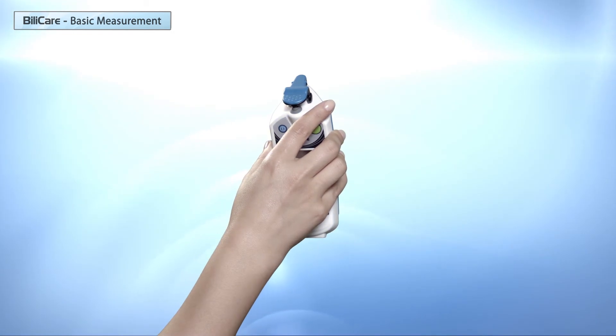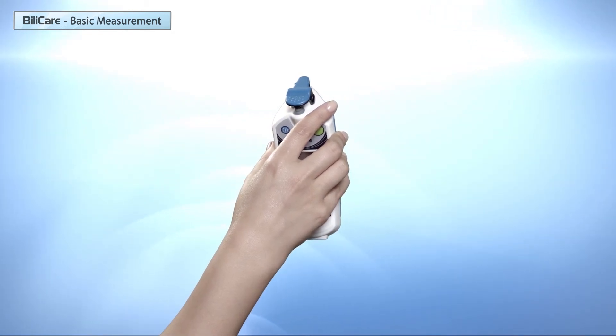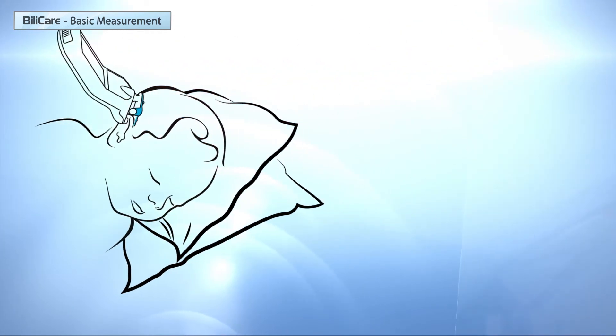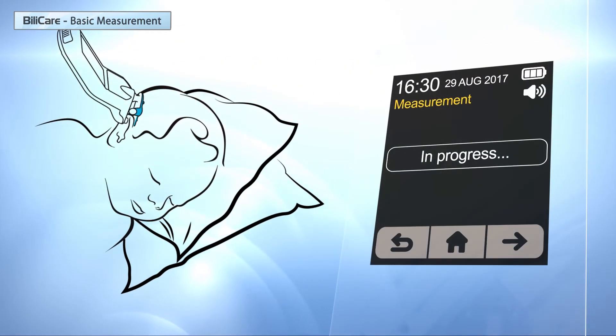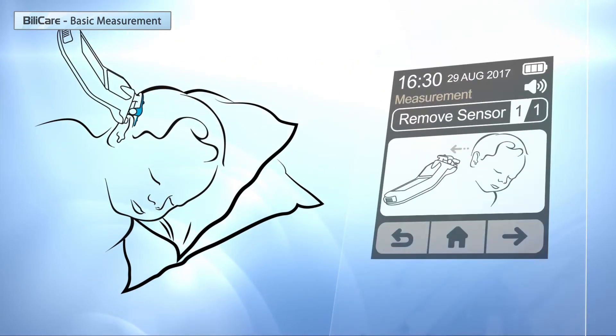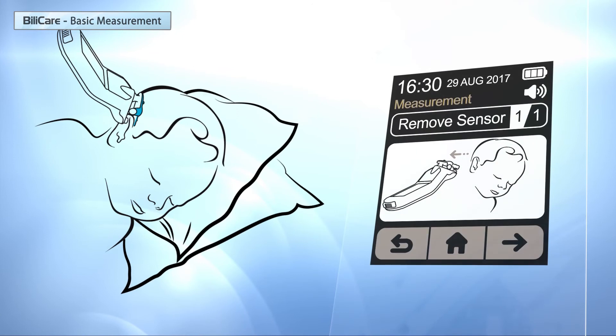After the sensor is placed, it is important to avoid touching the clip's lever. The measurement starts automatically and takes about two seconds to be completed. Once finished, a beep will be heard. Gently remove the sensor from the ear.